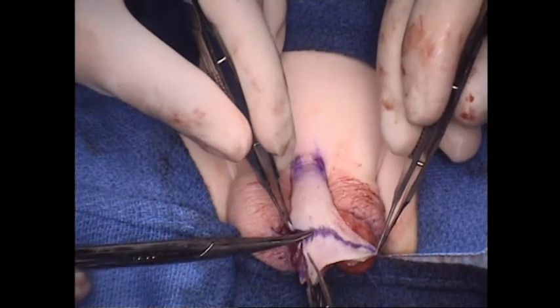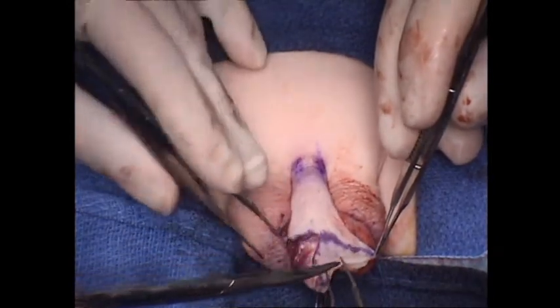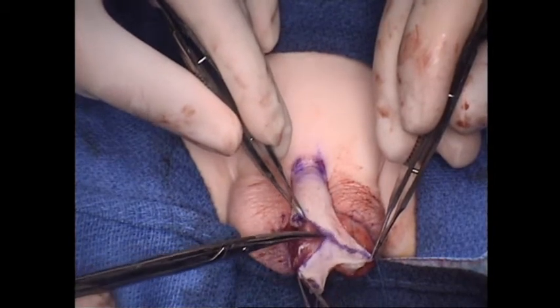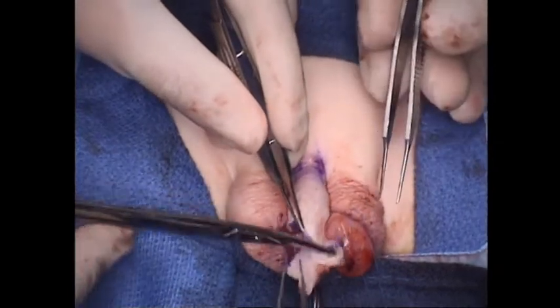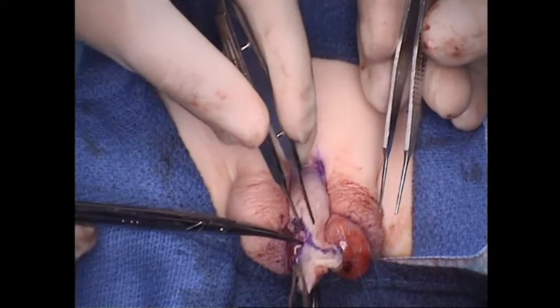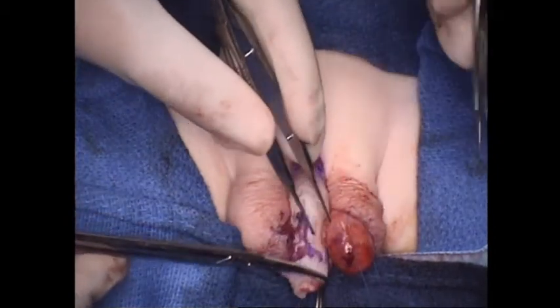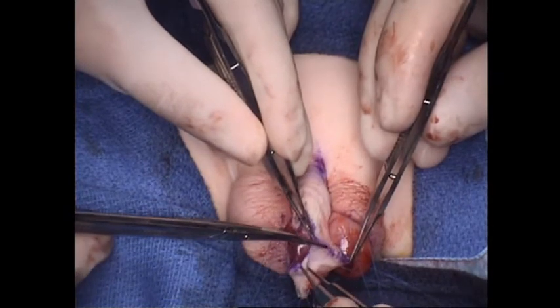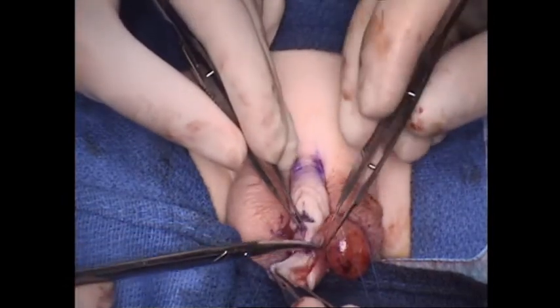So I'm cutting just simply right along here where all of this skin is going to fit right up next to the corona. So I'm doing my circumcision incision, my ventral penile skin reconstruction incision, and my graft harvest incision all with one fell swoop. I'm doing this pretty quickly today because, as he mentioned, we've done a lot of these and we know how it works. But this step should probably take you a bit of time the first few times that you do this, because you don't want to mess this up.